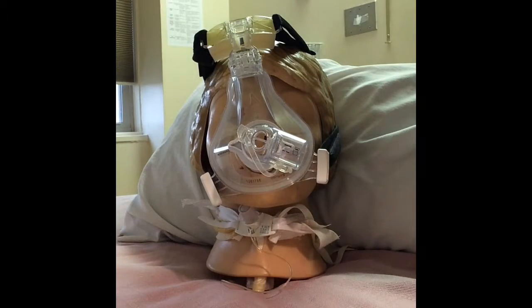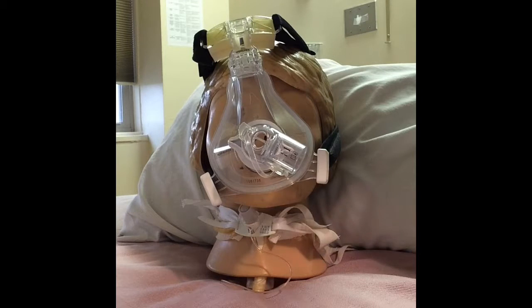Now, if your patient wants to eat and they're on the BiPAP and they're hungry and they're on relatively low oxygen levels on the BiPAP, then they can be just taken off the BiPAP and stuck on a nasal cannula, either a high flow or a regular setup.